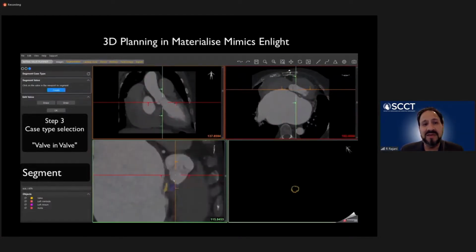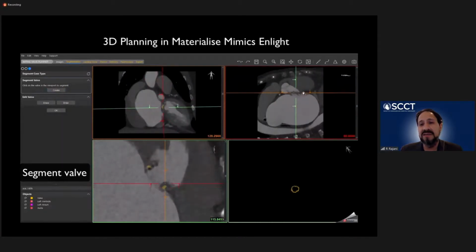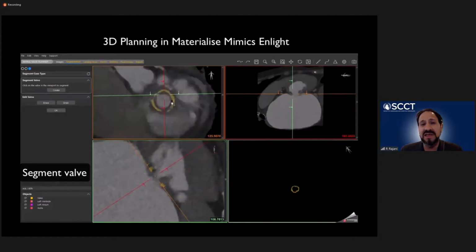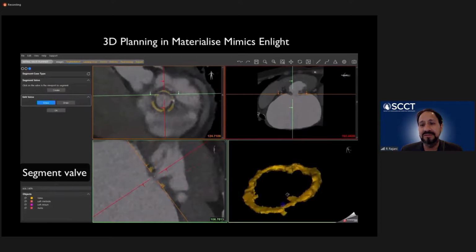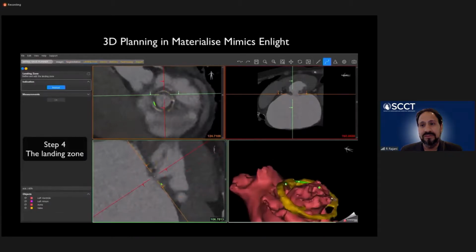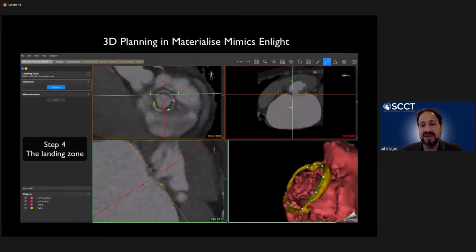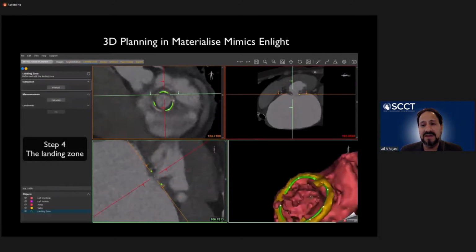And from the bioprosthetic sewing ring size, we'll be able to implant any valve that we wish to into this particular bioprosthetic valve that's degenerated and look at neo-left ventricular outflow tract obstruction. And you can see that we're just measuring the internal sewing rim so we can get the true ID of the valve type and size.